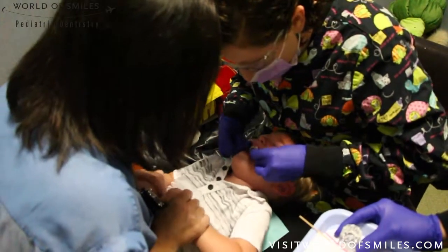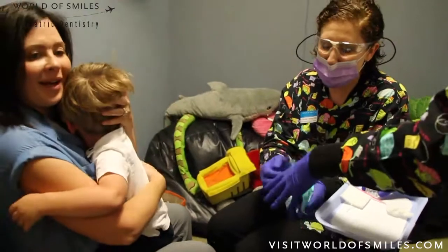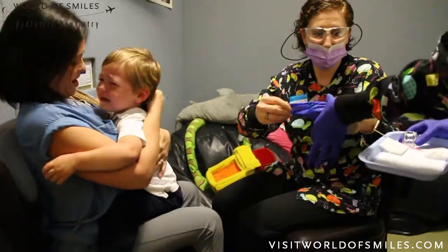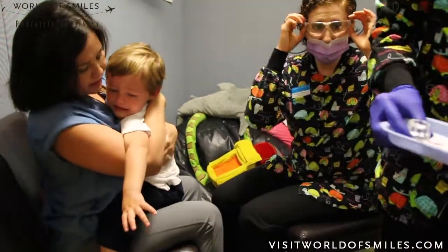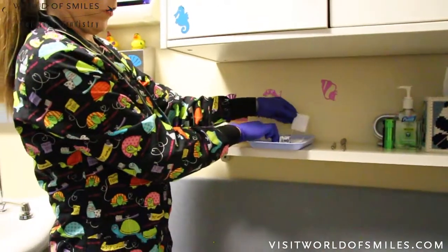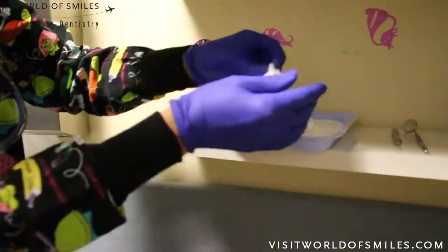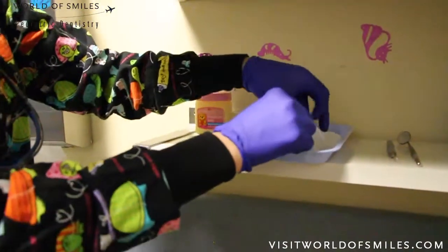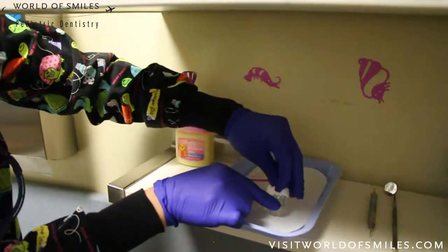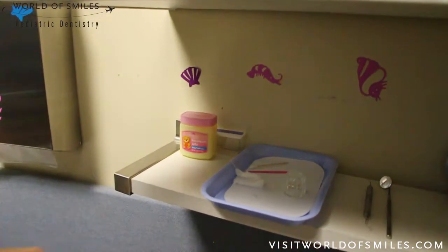I always warn parents that there could be some staining on the lips or cheek, but it does resolve within three to seven days. For cleanup, try to keep anything that could have been touched by the silver diamine fluoride contained in your gloves and immediately discard them. My assistant wipes any excess silver diamine fluoride out of the dappen dish with 2x2s, wraps them in her gloves, and immediately puts them in the trash to avoid any unnecessary staining.